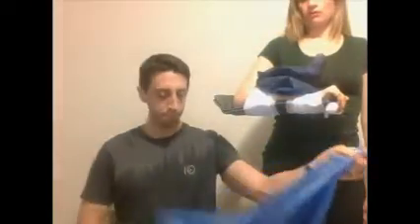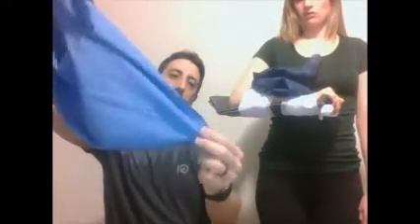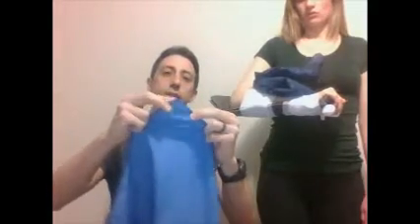And now we're going to help elevate this injury and keep it immobilized as well by applying a sling. So this is our splint that we have. We're going to apply a sling as well. So I'm going to use a triangle bandage. If I kind of back up, you can see this is what it looks like folded in half. If I open it wide out, it's a big triangle with one corner that is 90 degrees. This is the 90-degree corner. This is what I will refer to as the point.